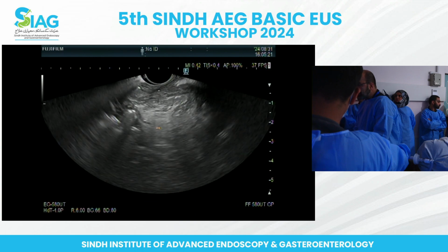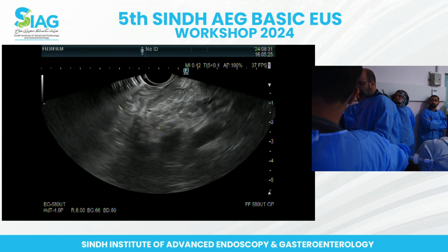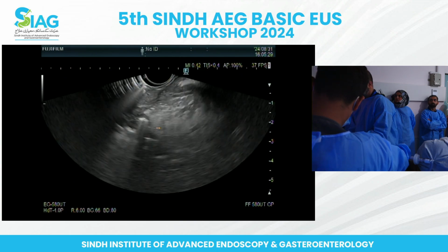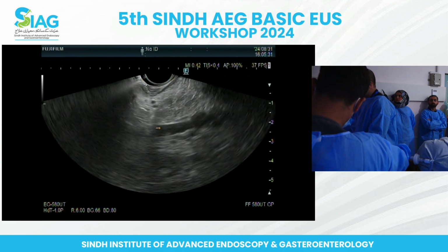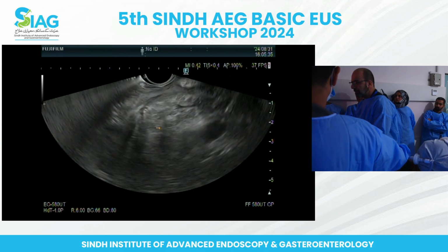So I don't see a pancreatic lesion. There's a lot of heterogeneity in the pancreas. Yeah, I think post-ERCP as well, there are changes.